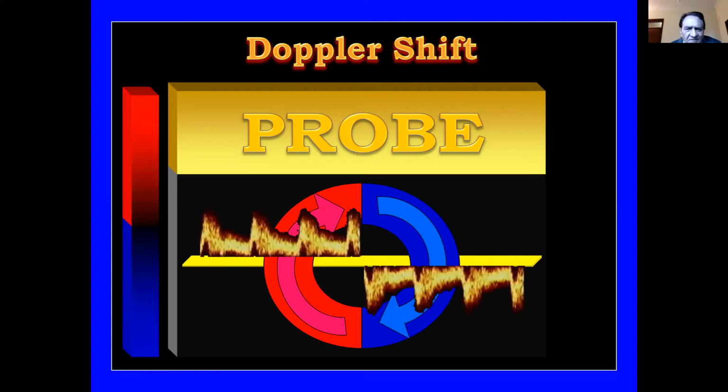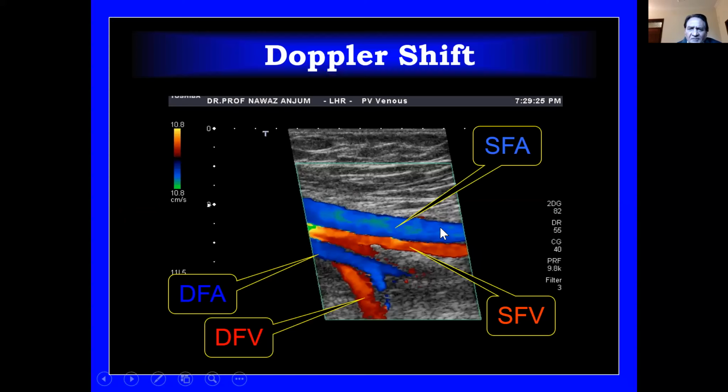And when you sit at the machine, the first thing you should look at is this color bar. The default setting is red above and blue below. If it is reversed, somebody has pushed the color Doppler reverse button, and you may mistake away from the probe for towards the probe. So the color bar must be looked at before you start anything. Here you can see the superficial femoral artery appears blue because the blood is going away from the probe. And here it is red, this is the vein, because the blood is going toward the probe.